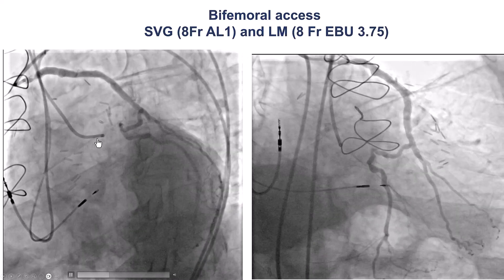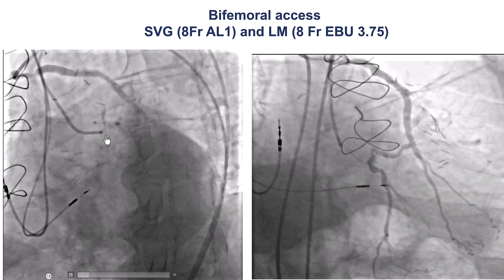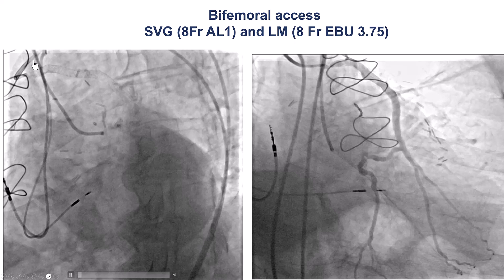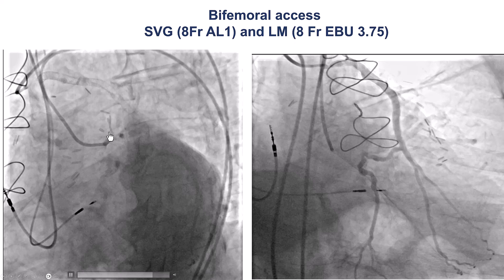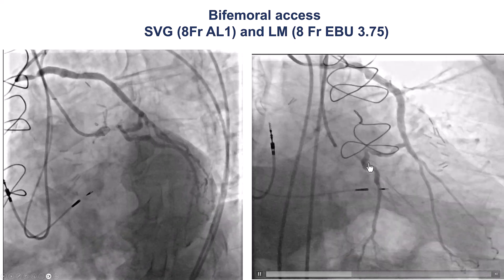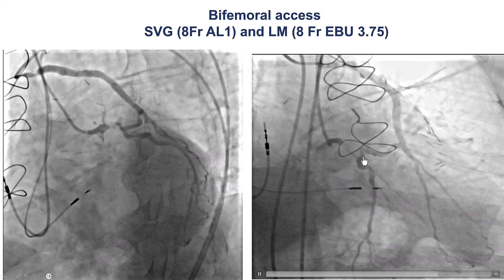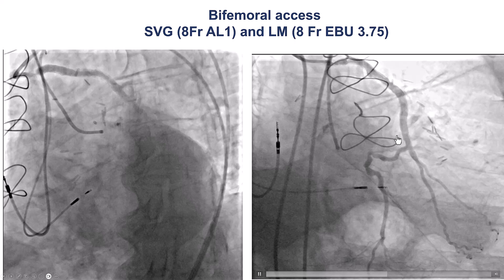This is a coronary angiogram with bilateral injection. There is an occlusion of the left main. There is a saphenous vein graft going to the Ramus that already has in-stent restenosis and has multiple previous stents. The occlusion is relatively short and there seems to be significant calcification. This is the caudal projection, showing that there is a bifurcation on the distal cap — specifically the circumflex as well as the Ramus branch that was the target for the vein graft.